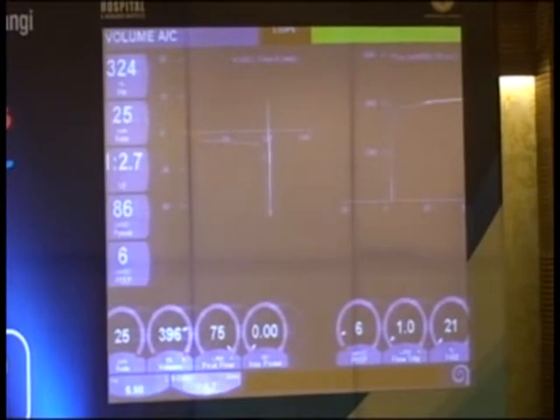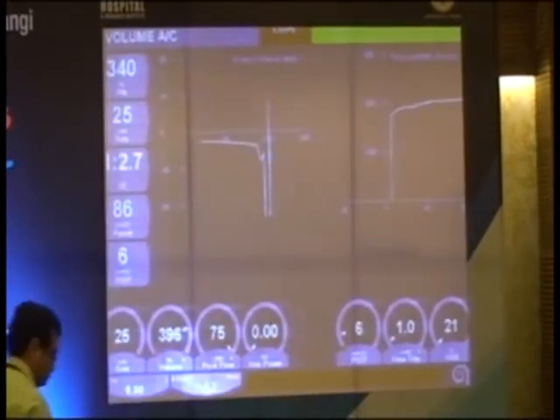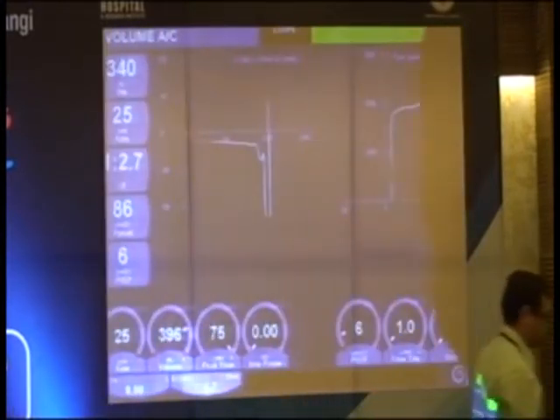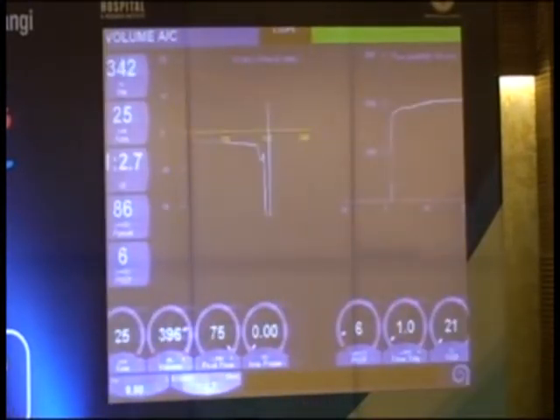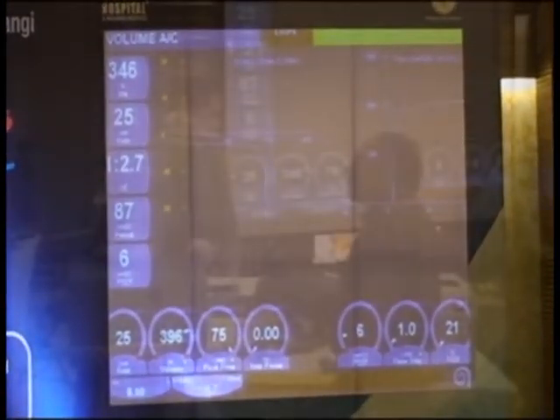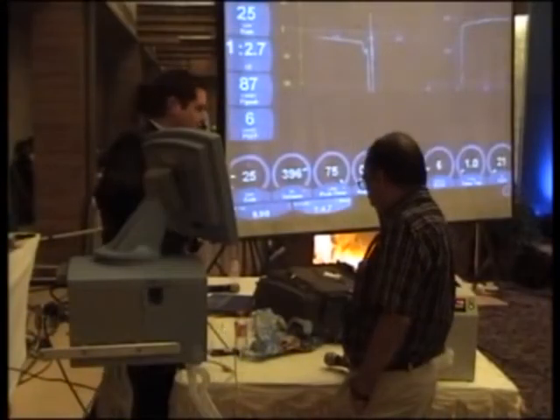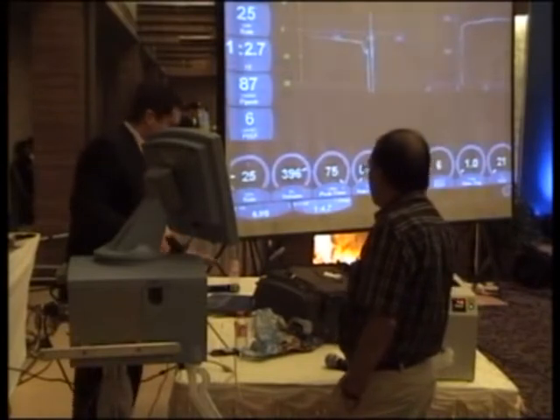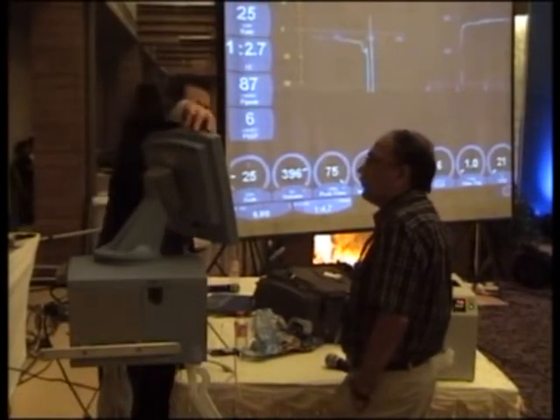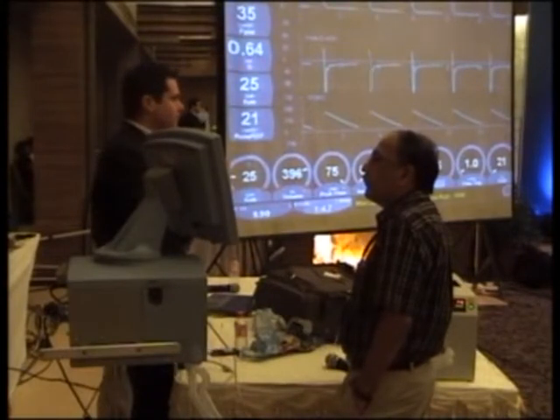Okay, my lung model's not responding to me. But what you would expect in a particular patient like this is that breath goes in, and then on exhalation, the flow volume loop is going to open up. And rather than having collapse, you would have gas return back to baseline rather quickly. For some reason, I can't get the lung model to do what I really want it to do, but that's what you would expect with a bronchodilator. Now, we still have a problem, okay?